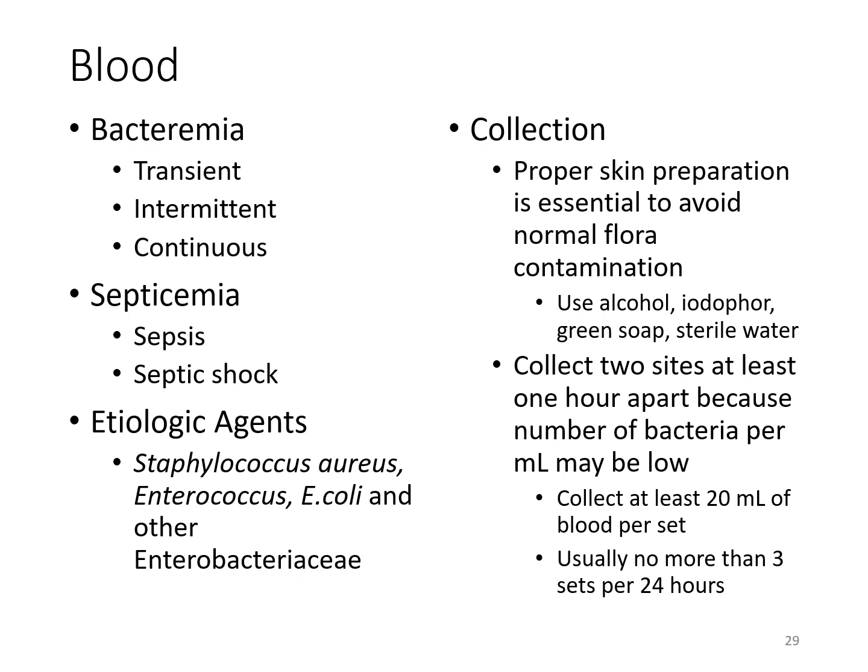To collect those specimens, you want to make sure that you properly clean the skin because you want to avoid any contamination with the normal skin flora. You're going to use an alcohol type of cleaner, as well as, depending on the site, it could be an iodine-based cleaner. It's really going to depend on the site and their preferences what they use for those blood cultures, but it will be alcohol as well as some other type of sterile cleaner for the skin surface.